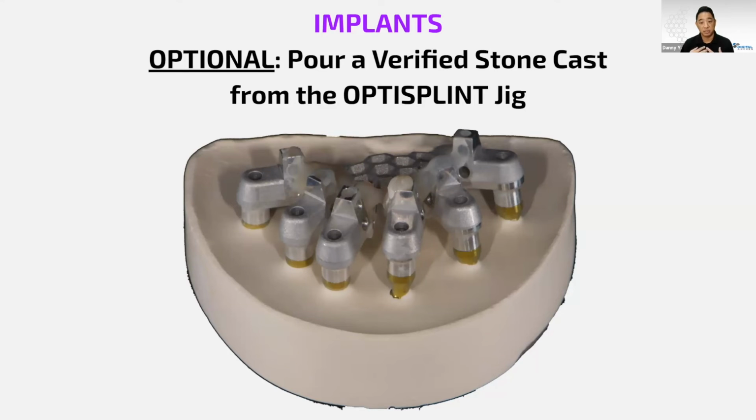a stone cast is a huge advantage in my opinion, and it gives the doctors, the labs, and everybody a common language to look at to make sure and to easily understand and be able to figure out where things might have gone wrong in the process if something is not fitting. It is optional, but we highly recommend doing it anyway.